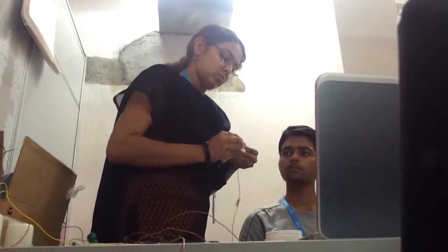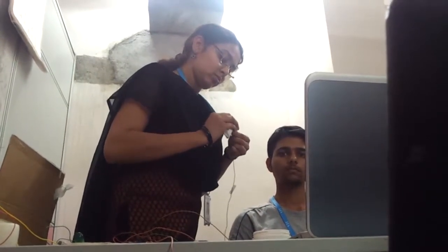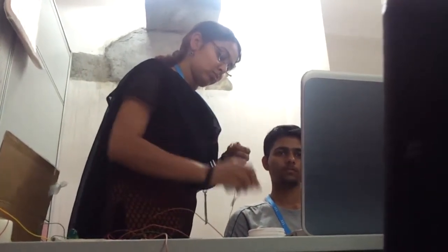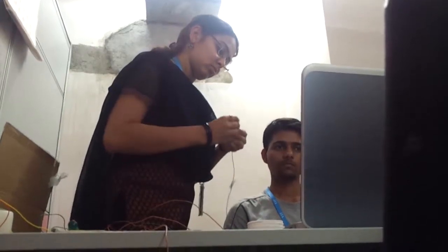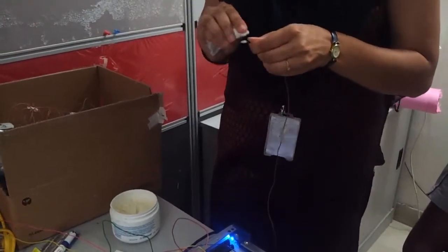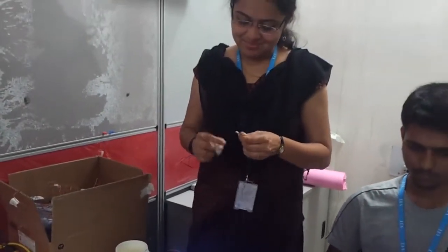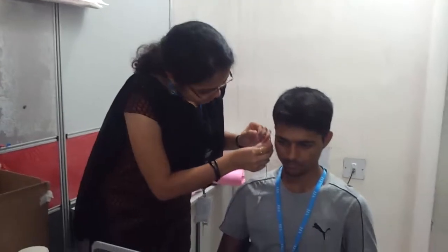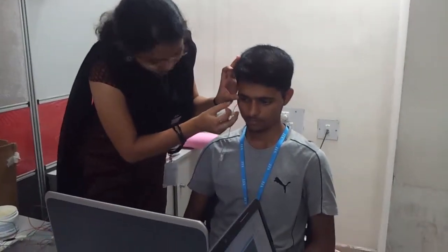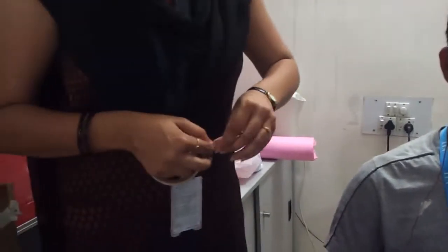I apply an electrolytic gel on the electrode as well as on either side of the subject's eyes, so that I can increase the conductivity. Here I secure the electrode on one side of the eye.